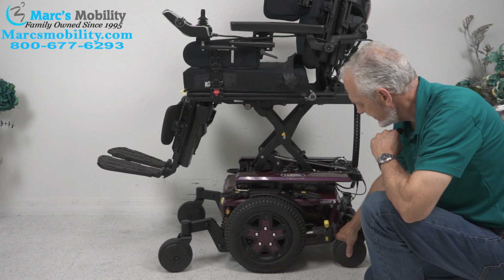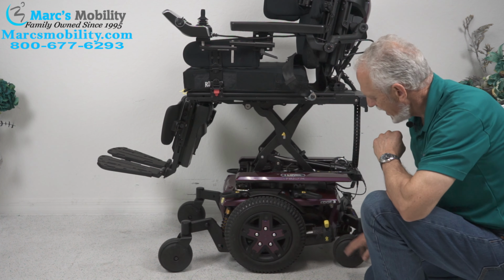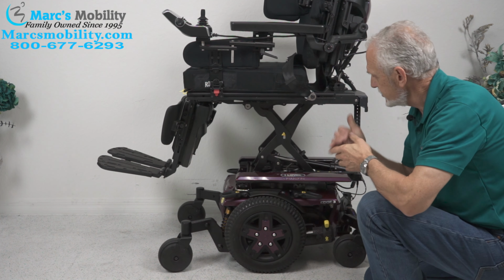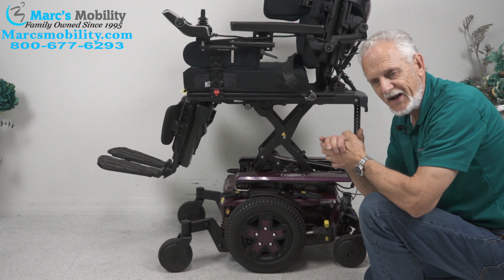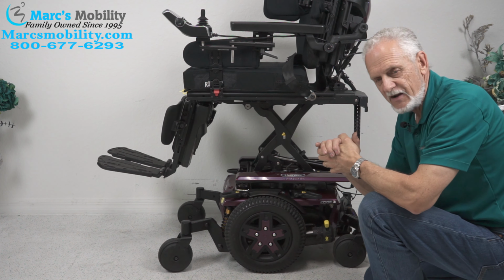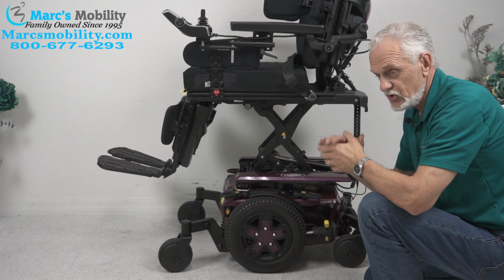Caster wheels in the front, caster wheels in the back. You have a motor for each wheel. Each wheel has an independent motor. This chair weighs over 425 pounds. So if you ever had to push it for some reason, it's pretty heavy, but you have to put it in neutral.